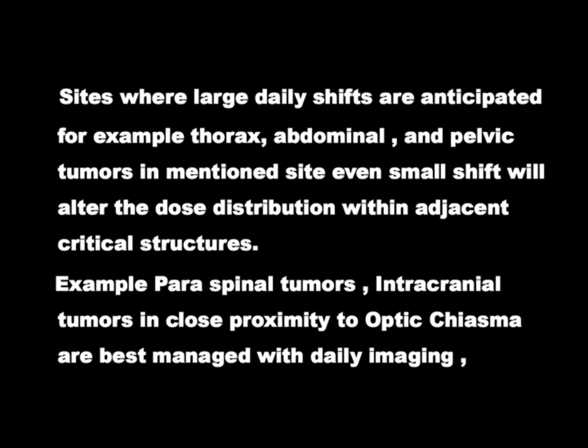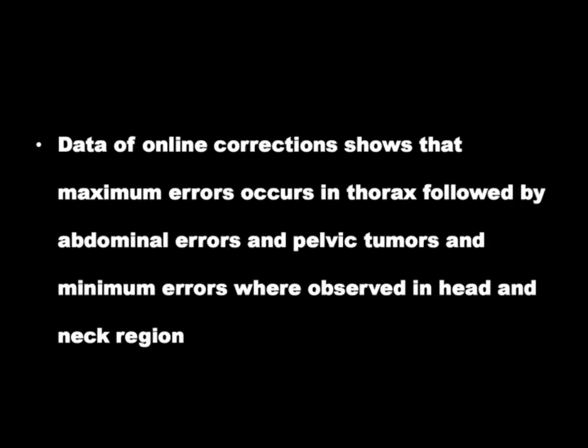So this is very important that we follow, though it's very difficult, the correction strategy that includes daily repositioning to register the patient position according to the base plan, so that a recalculation of treatment delivery in real time is done. That is most ideal, to reflect the patient presentation during the given fractionation, and then you have more accurate planning by this method.